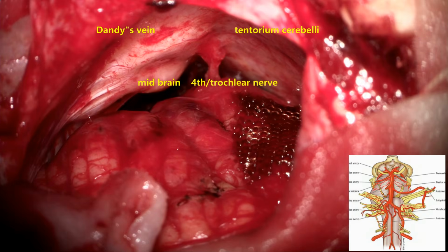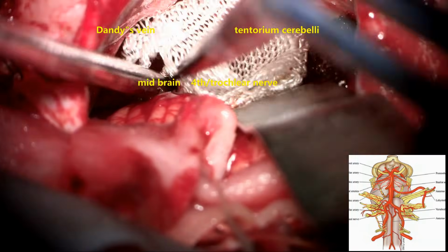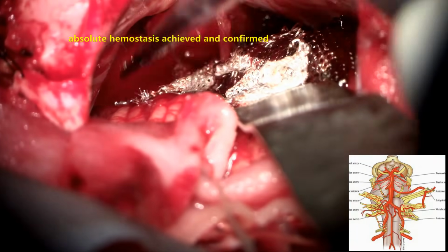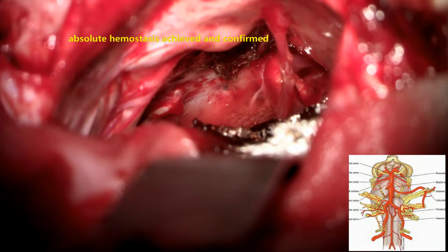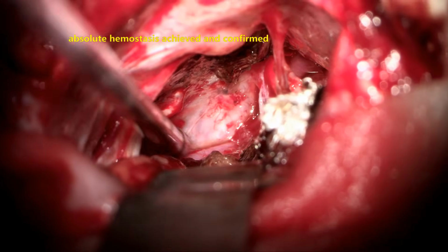Now coming down into the lateral cerebello-brainstem space. Here the cerebellum is lax and pulsating, and the cerebellum is gently retracted. That part is covered with Surgicel to avoid small oozes postoperatively. This is the complete excision of the lesion.